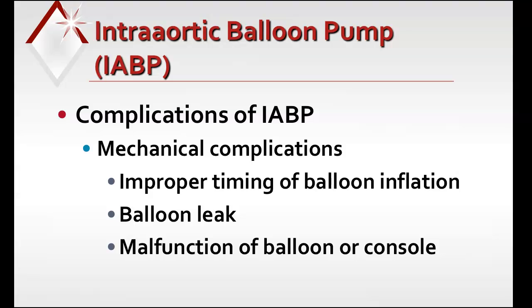If the balloon develops a leak, the pump will automatically stop. Okay, the catheter is promptly removed to avoid an embolus, and signs of a leak would include things like less effective augmentation of the balloon, repeated alarms for gas loss, and blood backing up into the catheter. You can also get a malfunction of the balloon or the console itself, which would trigger a fail-safe alarm, and it automatically will shut down the unit. So these machines are built with those safety devices in place.